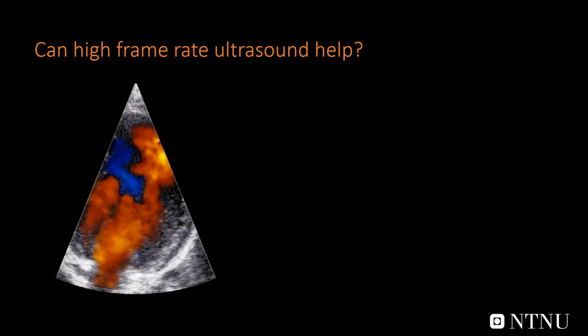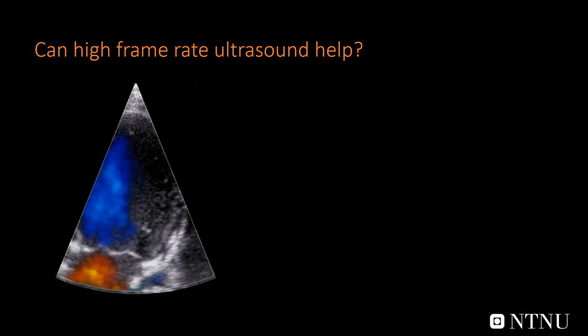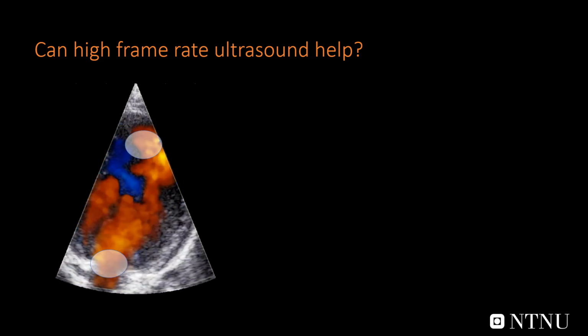Pressure differences are the driving force for blood flow, and being able to non-invasively estimate the base to apex pressure difference is therefore of high interest, and it's not a new idea.